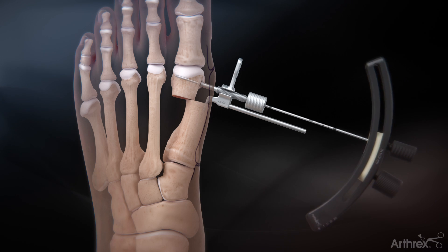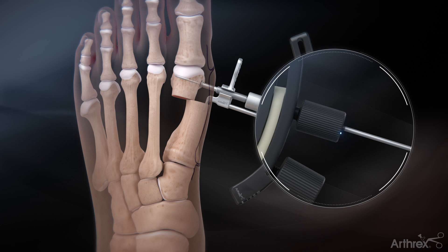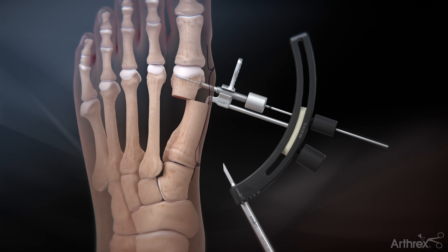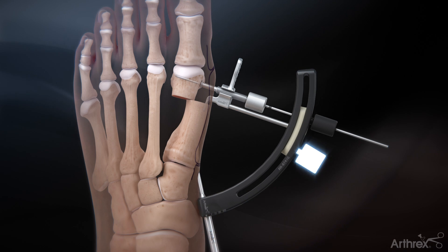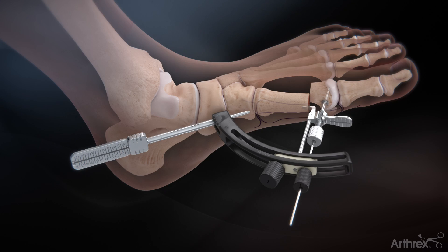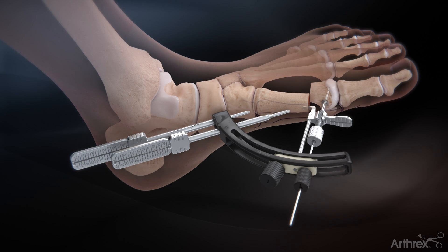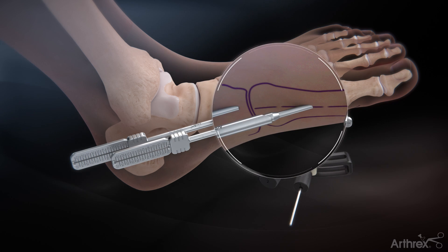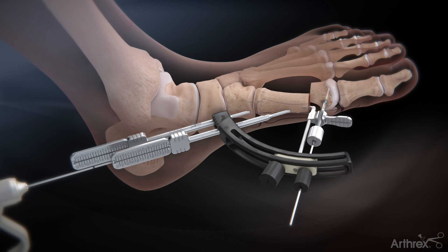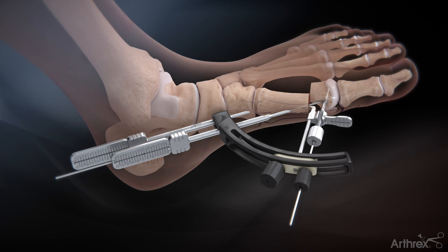Slide the guide over the capital fragment guide wire and tighten knob 1 such that the top of the knob is flush with the thickest laser line. With the first K-wire sleeve in the most proximal slot, slide the guide proximally and tighten knob 2 based on the desired entry point for the proximal K-wire. Insert a second K-wire sleeve into the most distal slot, ensuring contact at the drawn midline of the metatarsal. Advance a K-wire through the sleeve and confirm bone purchase. This K-wire serves as temporary proximal fixation to align the guide to the metatarsal.